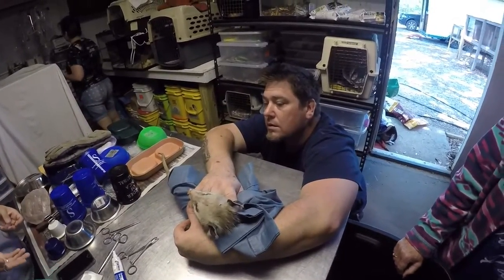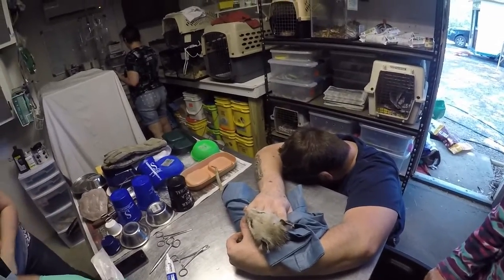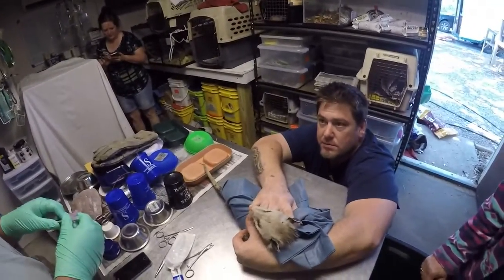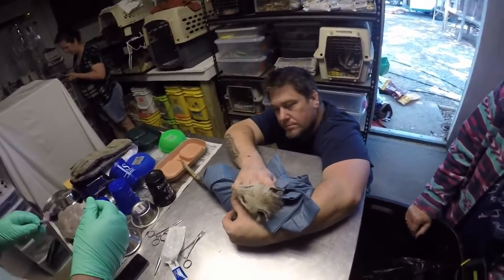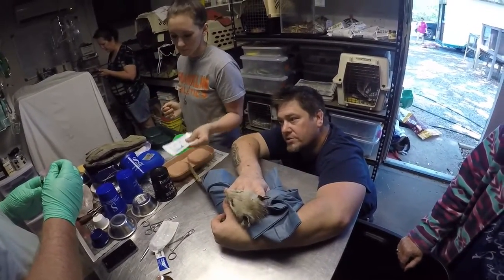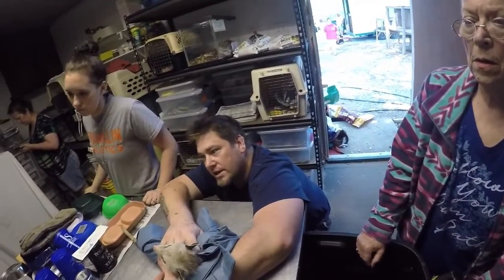Do you need a suture? Yes. Oh God, where's the suture, Abby? I have no idea. Up here. So you're going to need him on his other side. Pull that off — that's the locking mechanism, so pull it back towards the syringe. There you go. Whenever you're done, it locks the needle.